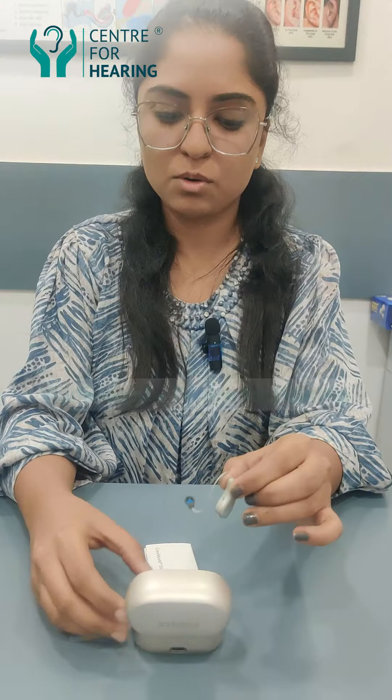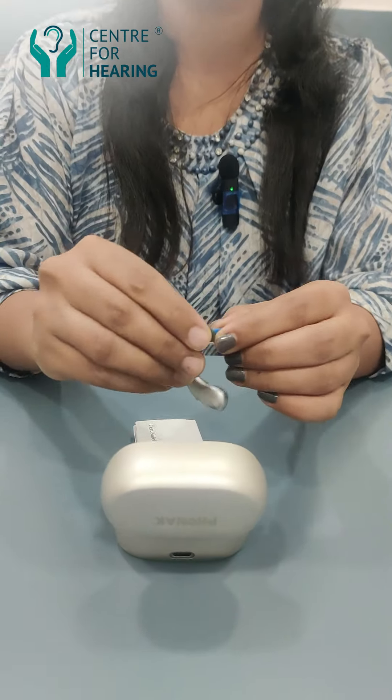Hi, I am going to show you how to change the wax guard of a Phonak hearing aid.